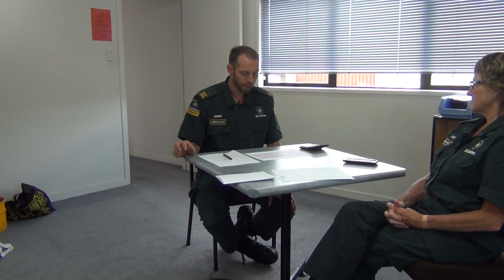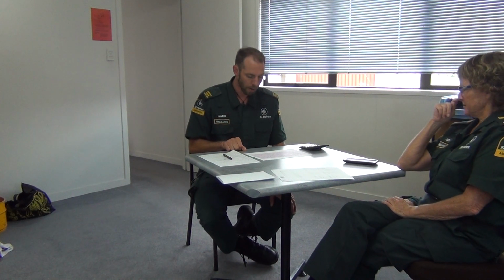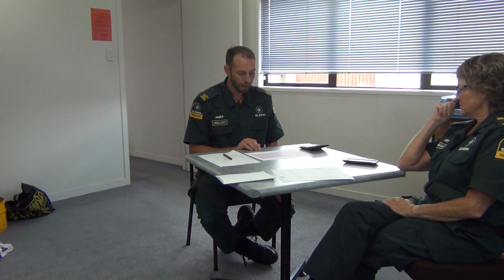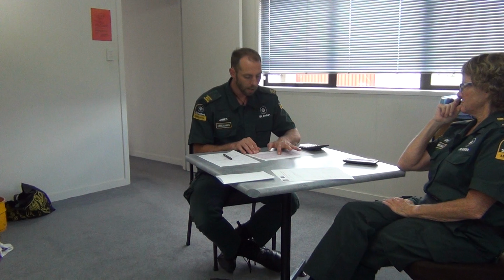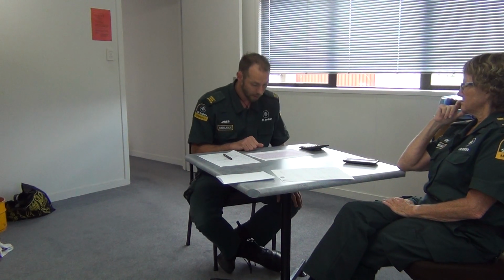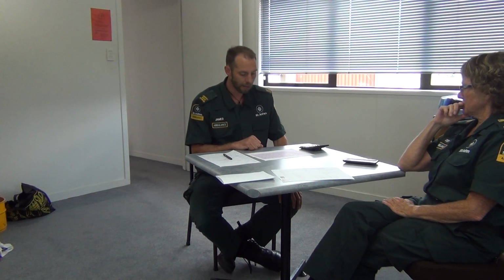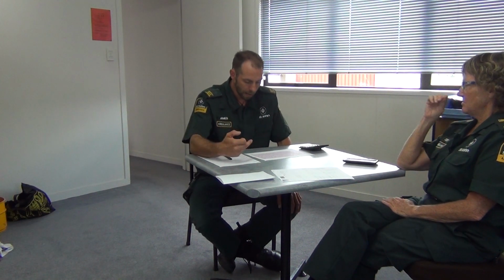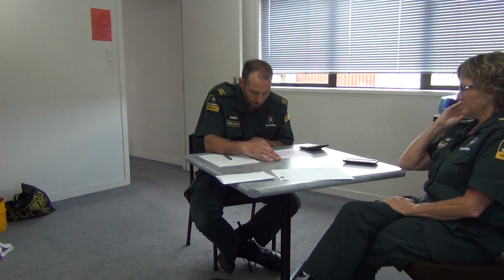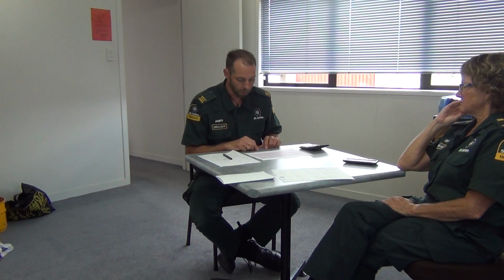Just looking at the ischemia, which I mentioned earlier that I could see in V2 and V3. This is a 20-year-old male, and when you have a 20-year-old male, the mass of the heart is a lot greater. So there might be ischemia here, but it's not greater than 2.5 millimeters, and therefore doesn't indicate ischemia. You still have another minute if you need it. Okay, so in V4 we've also got some ischemia as well, but that lead is in isolation, so that indicates that it's not ischemia.